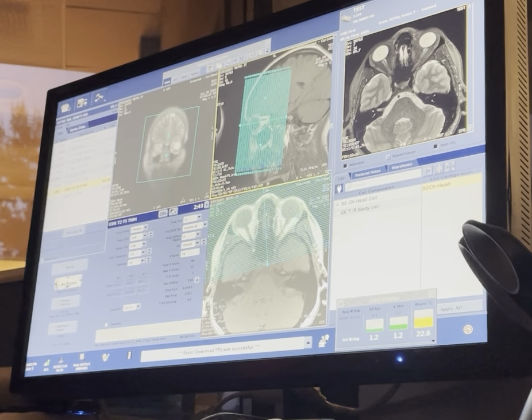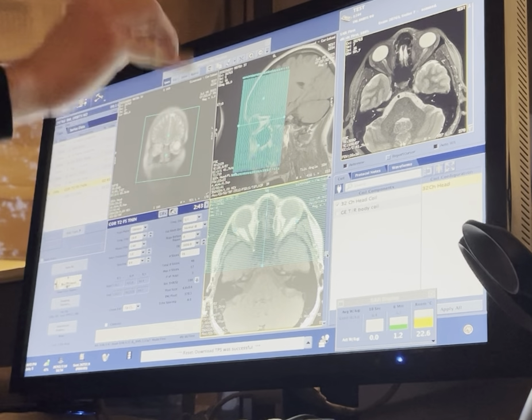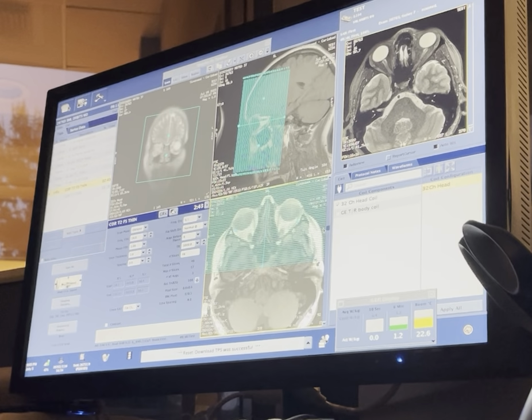Now we're gonna go over here, and we're gonna flatten that out and make sure we just rotate it. Don't add anything. Remember, we angle first. So now we're looking at the top-down view, and that's why it looks like slices. So just angle it and make it flat so that both globes are starting on the same slice. Go a little more, tiny bit more. Yeah, let's do that. Now scroll through and let's find the highest point of the globes.